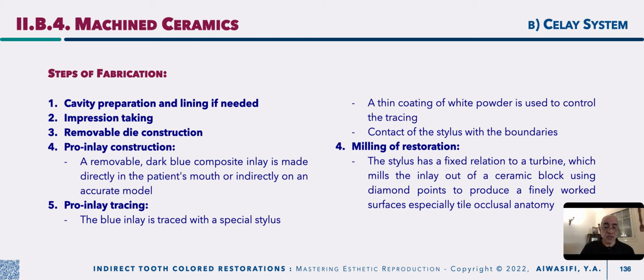The accuracy of your inlay will depend on the accuracy of constructing your pro inlay. Then this pro inlay is responsible for the marginal adaptation and the anatomical form created for this restoration, as well as the fitting surface accuracy of your restoration.